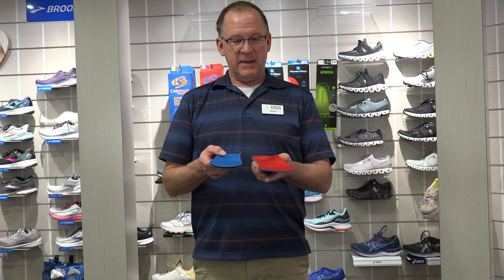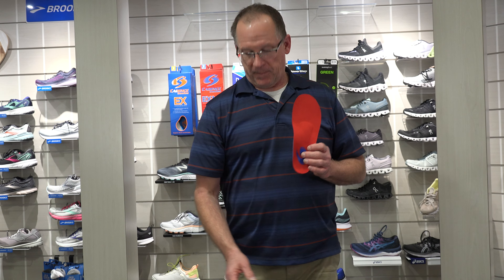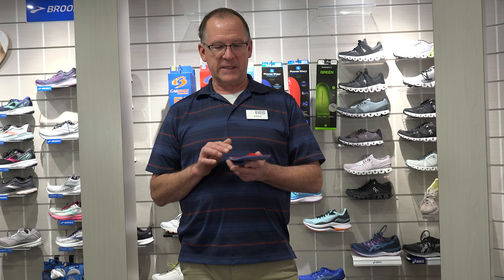These are the Cadence. The red one, the EXMP, has all three arches: the medial, the lateral, and the transverse. I'll explain this to customers when I'm talking to them. The blue Cadence just has the medial and lateral — there's no transverse arch. Most people, from what I've found, really enjoy the transverse arch. I use it for a couple of reasons: one is there's an arch there, so why not support it?